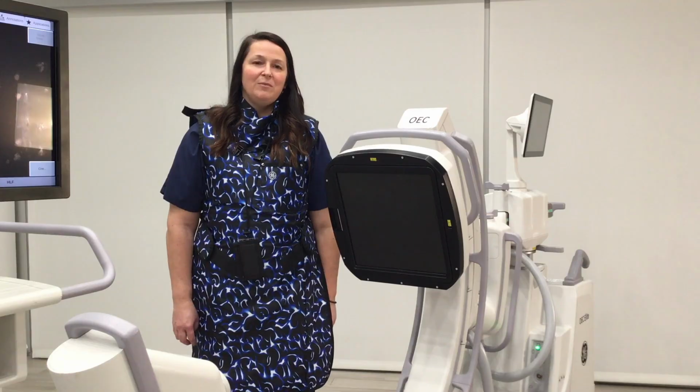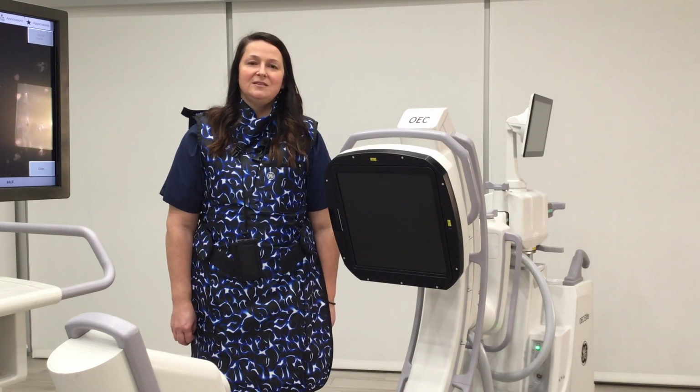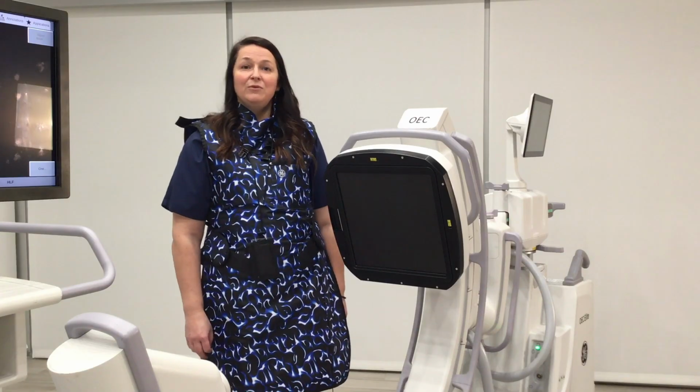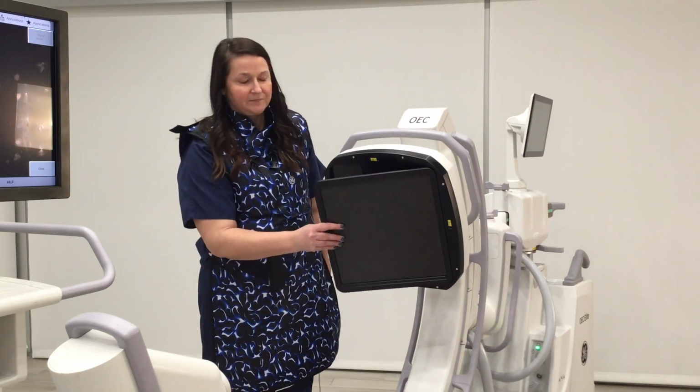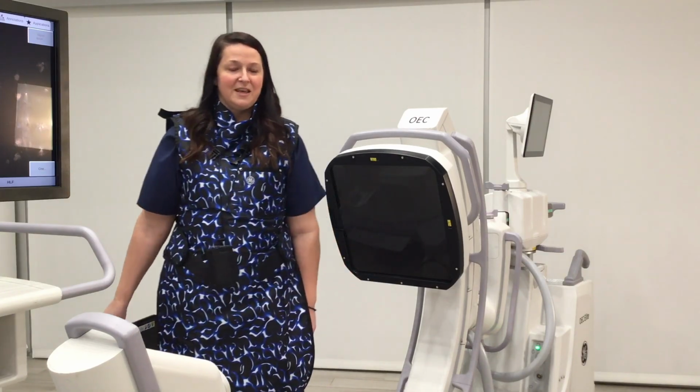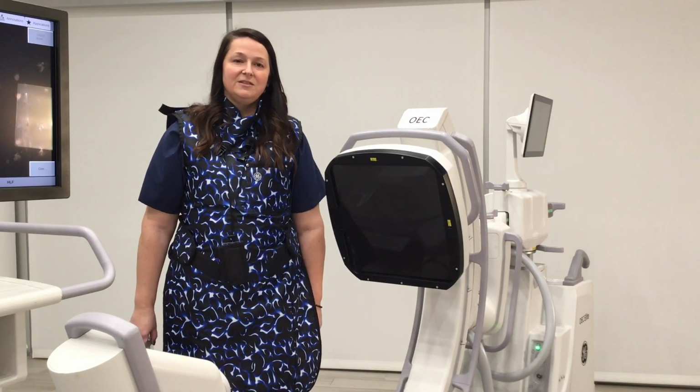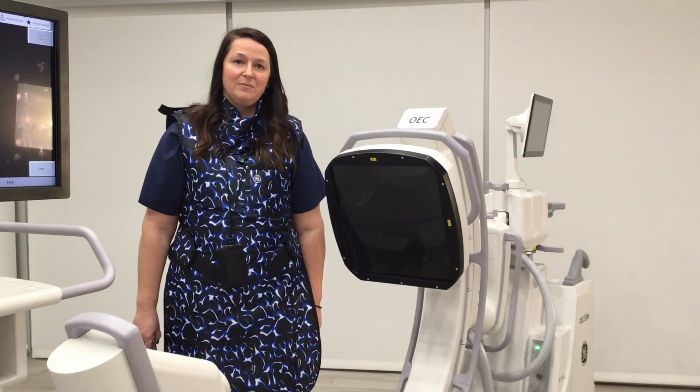When imaging small body parts or pediatric patients, a recommended thickness of 10 centimeters or less, you can, when available, remove the grid and simply store it somewhere safe. By removing the grid, you can utilize lower technical factors, therefore reducing the overall dose to the patient.